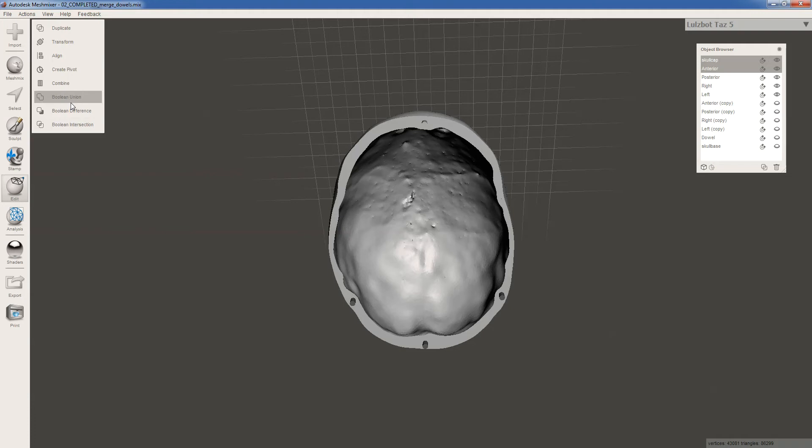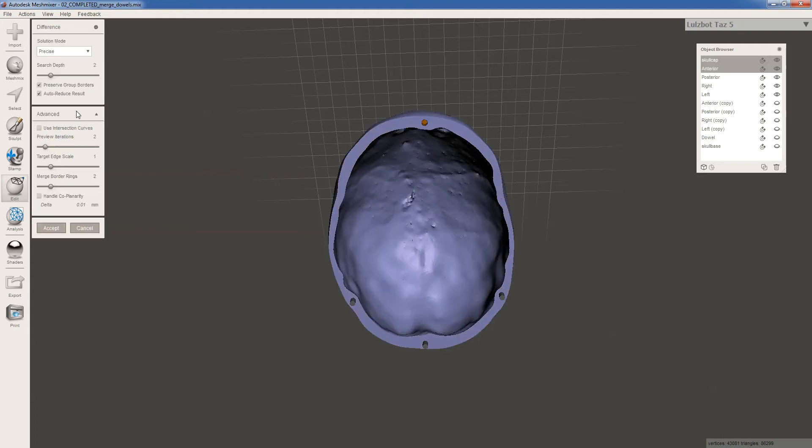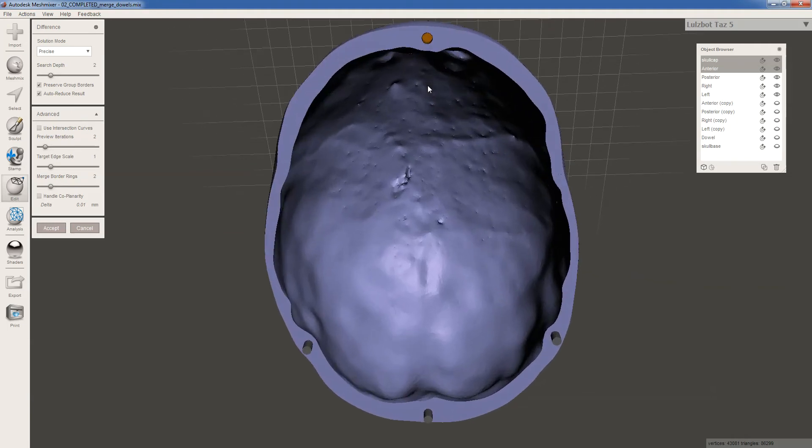Sometimes it can be a little hard to tell what's being subtracted from what, so you can just click Boolean difference and it's going to show you what's happening. It just so happens that I selected skull cap first and anterior second, and that's what I want — it's actually subtracting the dowel from the skull cap, not deleting the whole skull cap. If your whole skull cap is gone, you probably selected them in the wrong order. Go ahead and cancel, reselect, and then select difference again. There's this option to auto-reduce result, and I've found that it tends to warp the edges a little bit, and we're not that concerned about the triangle count inside this little cylinder, so I always uncheck that so it looks as good as possible.